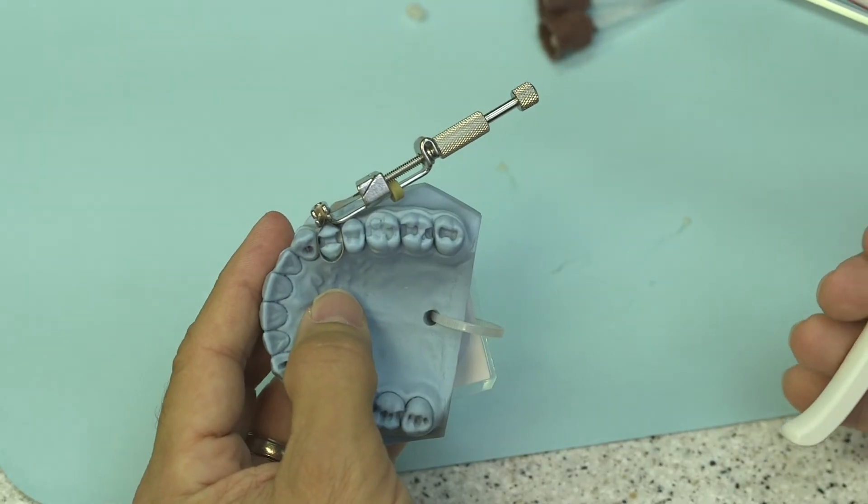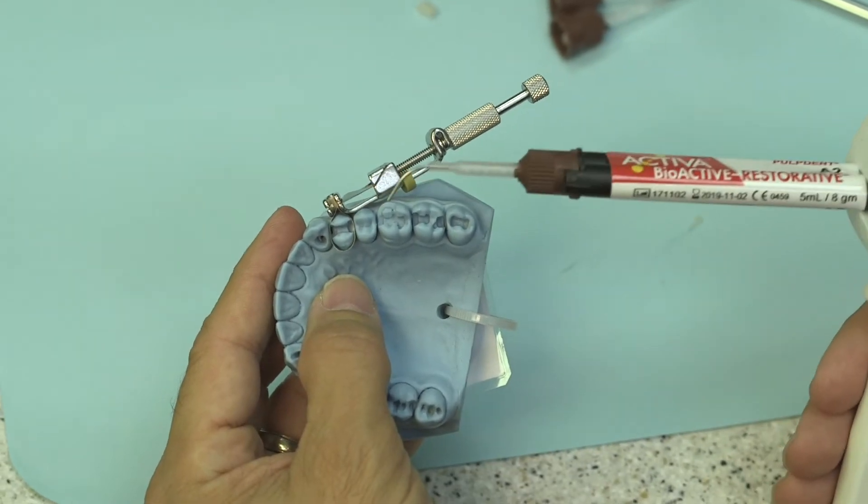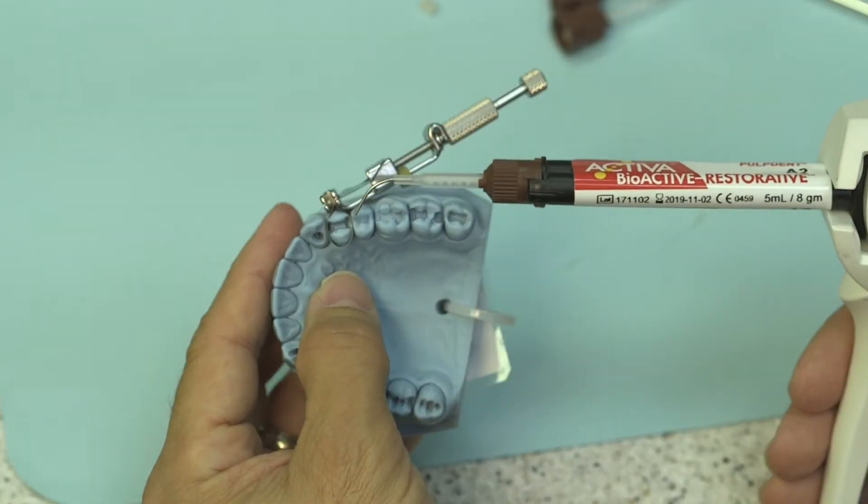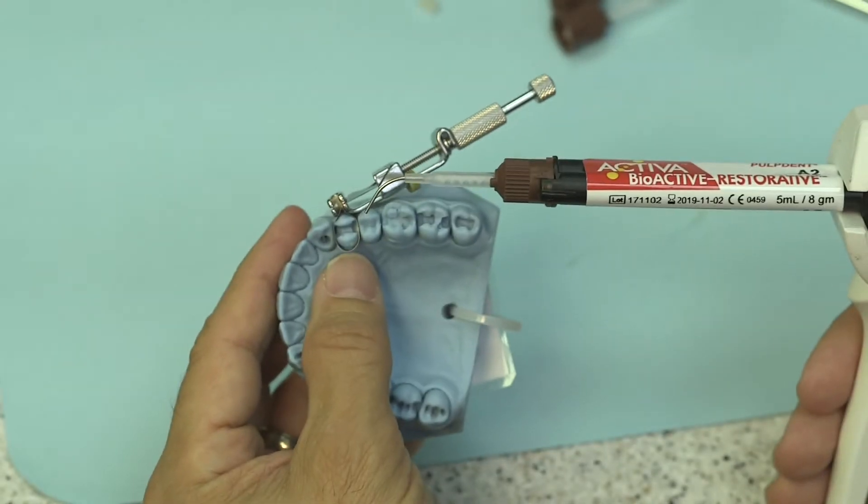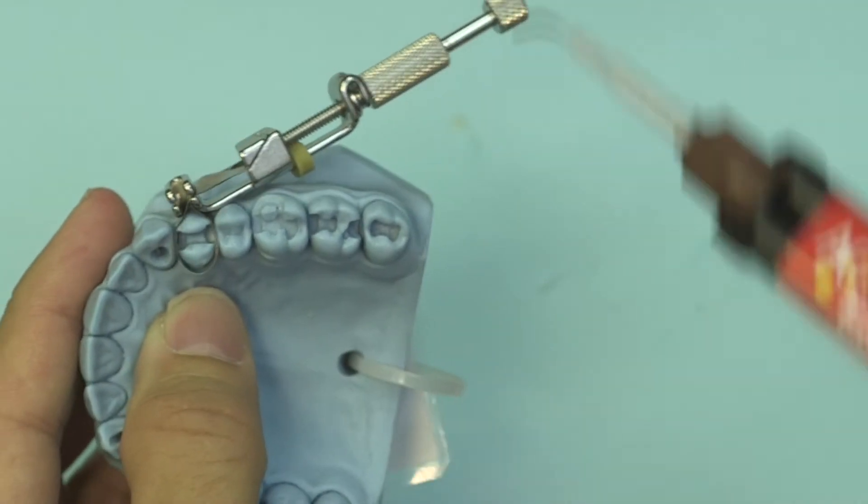So I've placed another tip onto the Activa material and that's the enamel of the restoration. We've placed our bonding material within there and cured that according to manufacturer's instructions. We're now going to go ahead and fill this restoration.